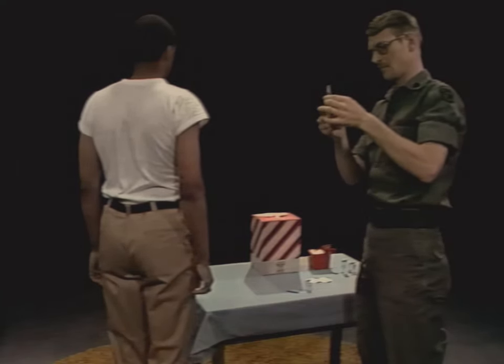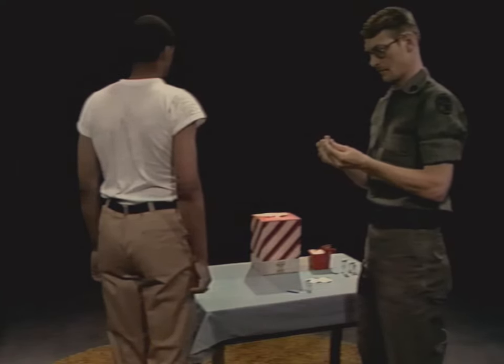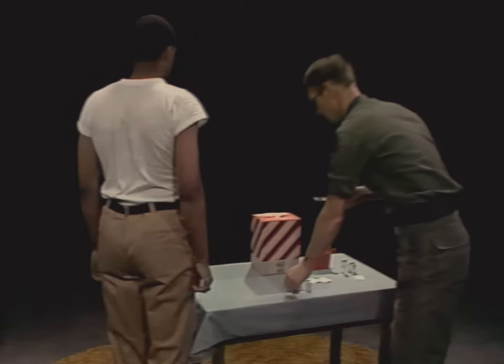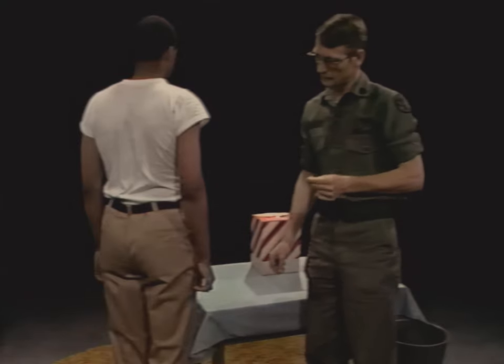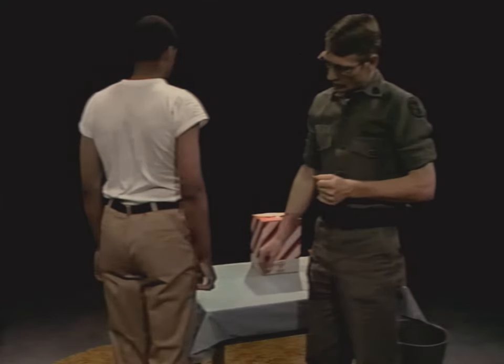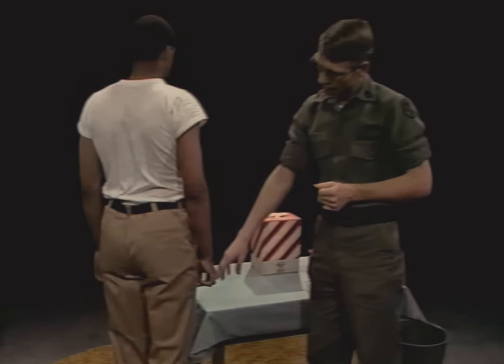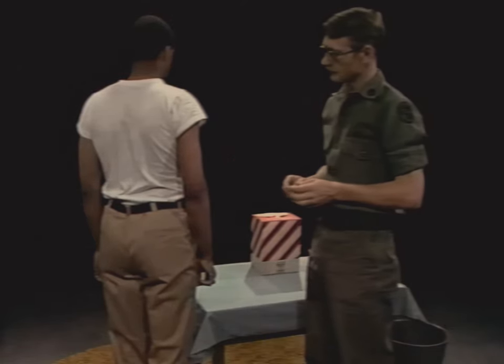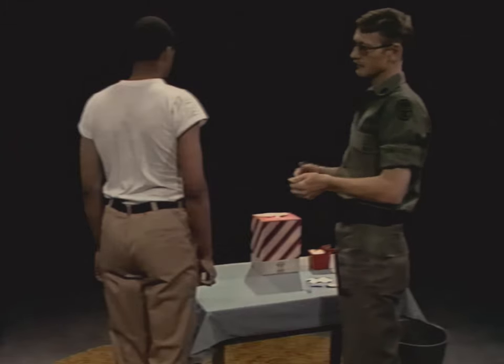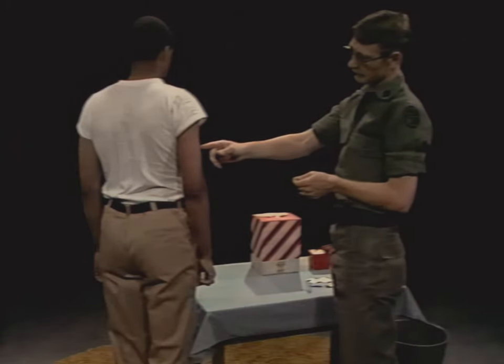After you've washed your hands, assembled, checked, and loaded your equipment, you begin by locating a suitable injection site. There are many suitable injection sites. The most commonly selected are the outer part of the thigh and the upper arm. During this program, we'll use the posterior area of the upper arm, here toward the back of the patient's arm.